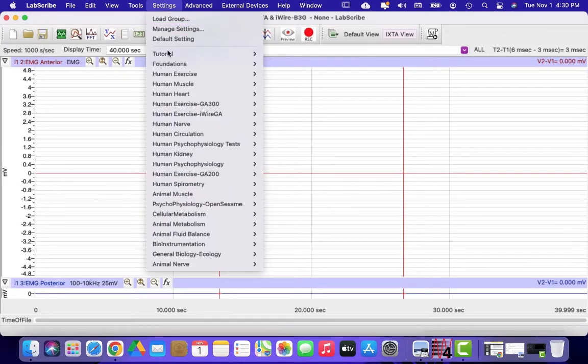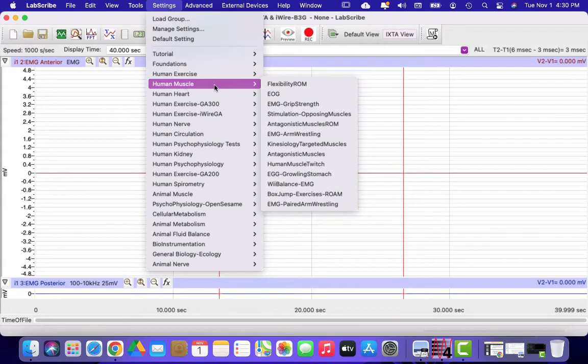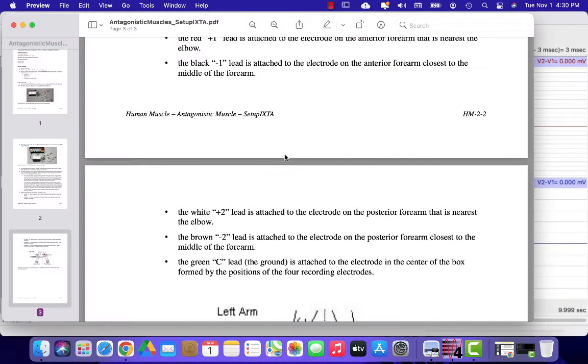Go to Settings and choose Human Muscle and Antagonistic Muscles. A PDF is going to pop up — we don't really need that so you can just minimize that file.